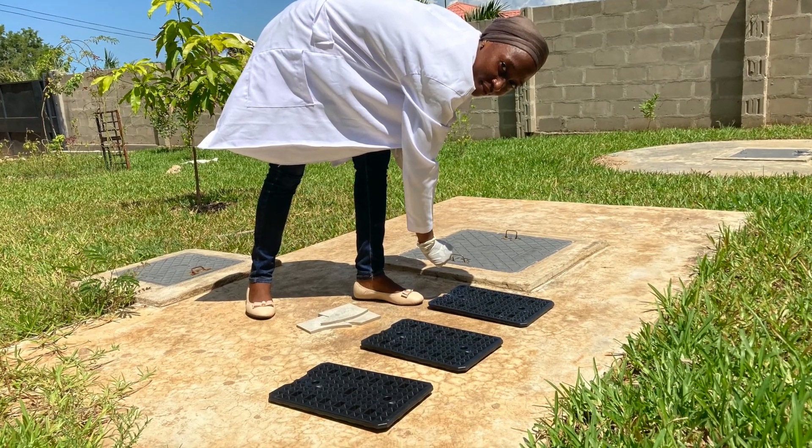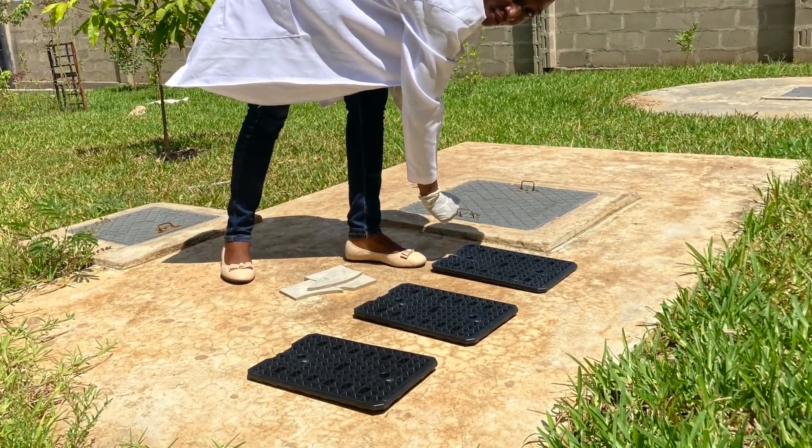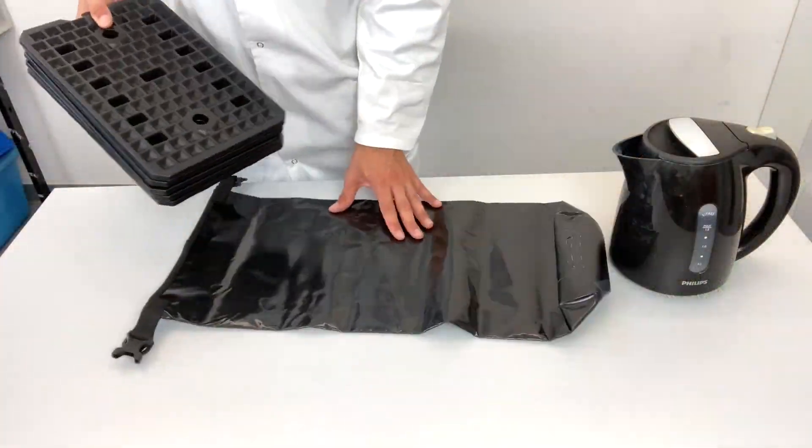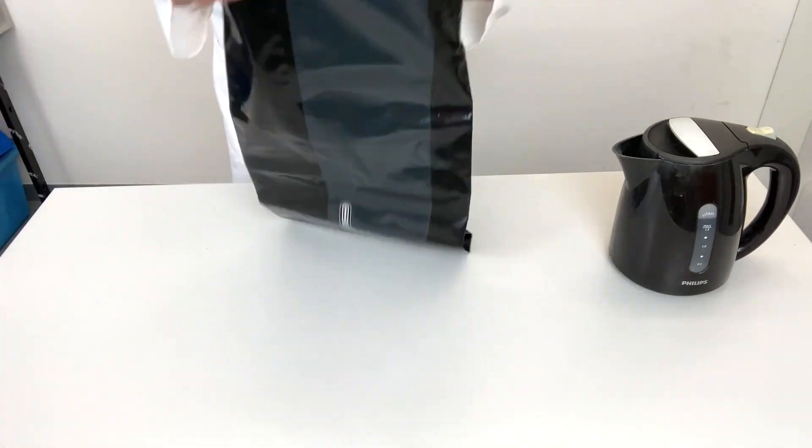This happens either by sunlight—simply place them into the sun for about 20 minutes—or by 4 liters of hot water hotter than 80 degrees.